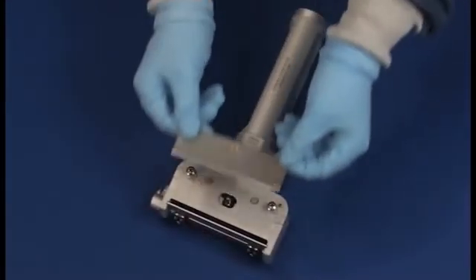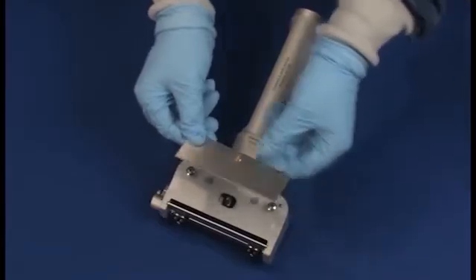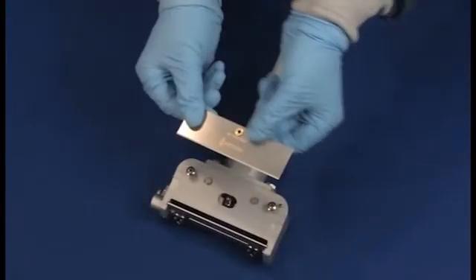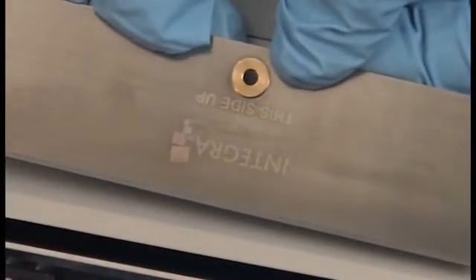To install the blade, check to make sure that the blade and blade bed are free of any lint or foreign matter. Note that one side of the blade reads 'this side up' and features the Integra logo, while the other side is blank. It is important to keep the side that reads 'this side up' facing you during the installation process.